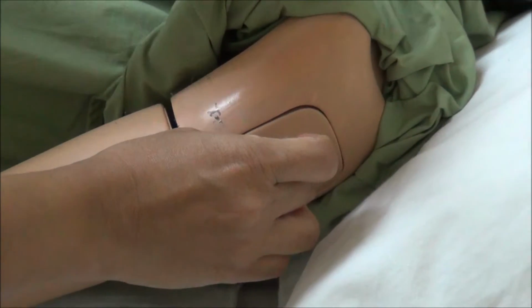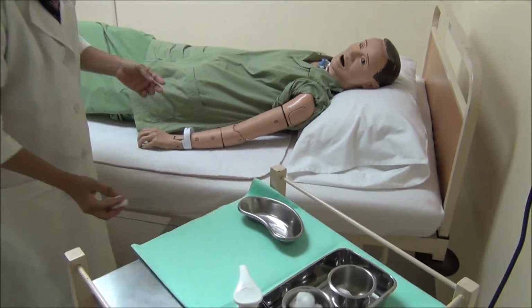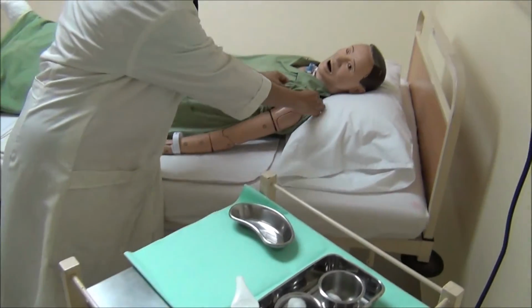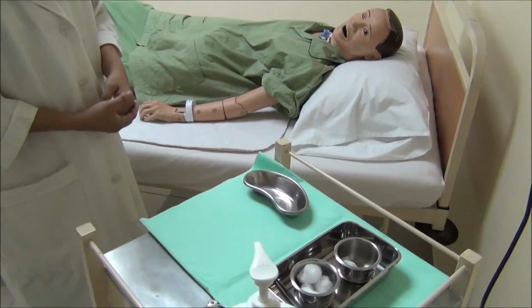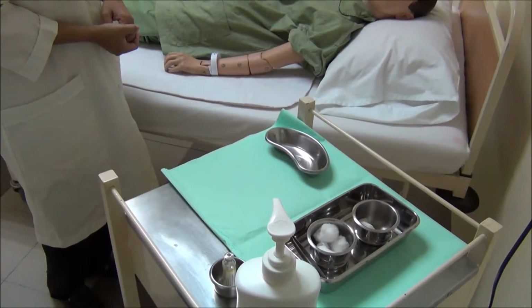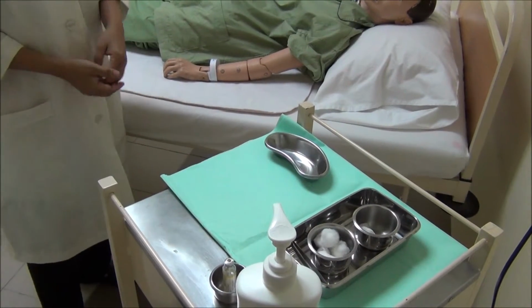Okay, after you have administered, she has withdrawn the needle smoothly and applied gentle pressure using dry cotton. Discard the uncapped needle and attach syringe into the sharp bin. Tidy up the area and make patient comfortable.